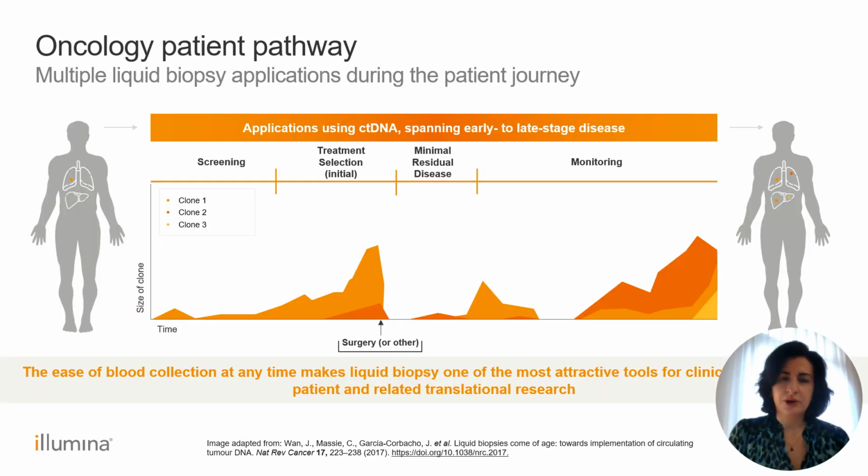So where is liquid biopsy ctDNA-based analysis applicable? Basically at all stages of the patient journey, and especially when you do research in cancer, you can have liquid biopsy applications to discover more and have more insights into every stage, actually from early detection or even early screening through therapy selection, minimal residual disease monitoring, and monitoring of tumor progression. The point here is to consider that you need a powerful solution which will reflect the needs of your experiment.